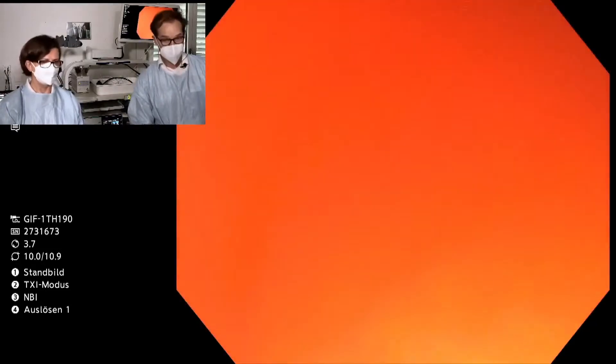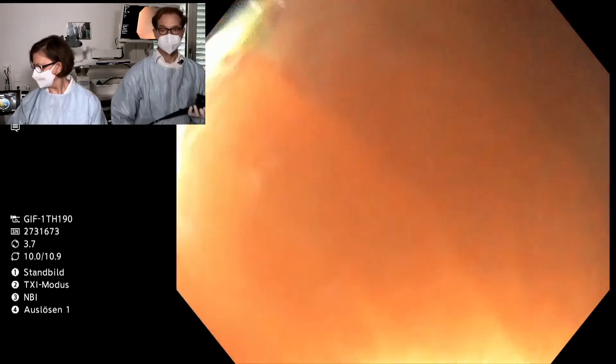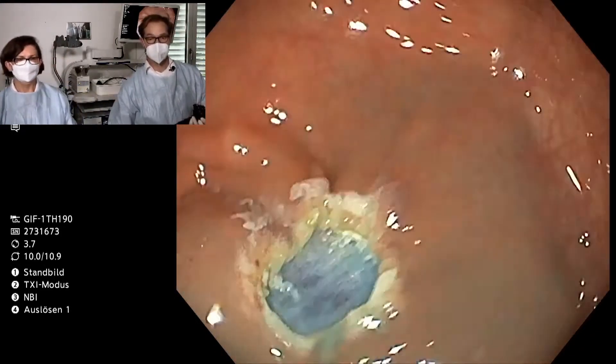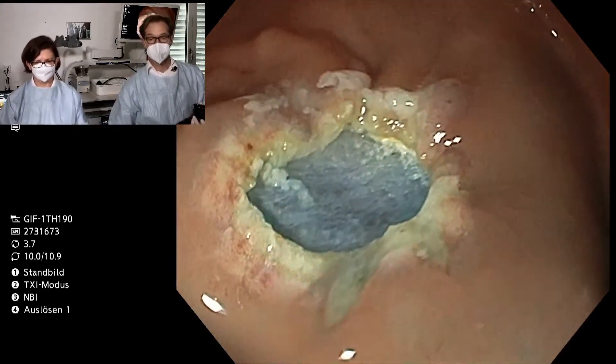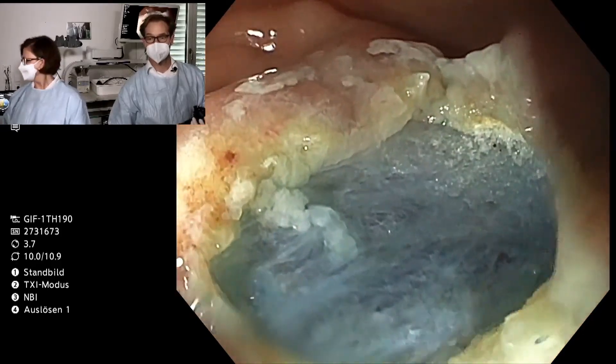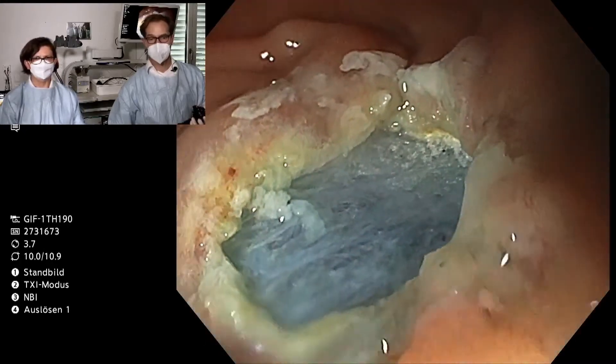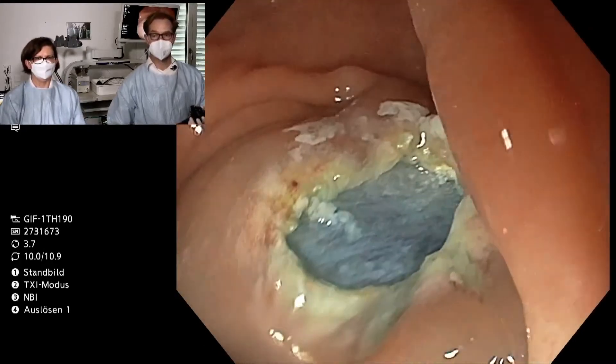I have removed the DUET system and will take a look again without a cap. I will try to close the lesion with some clips. The site looks perfect — also no vessel to see. I don't think I have anything to coagulate. I will try to close the lesion with two clips.